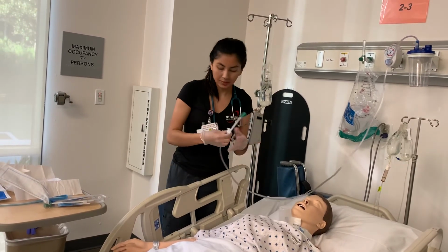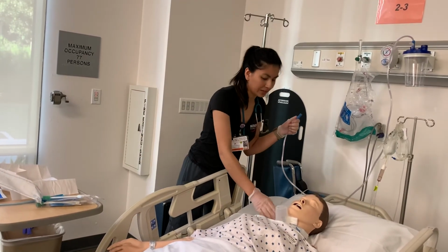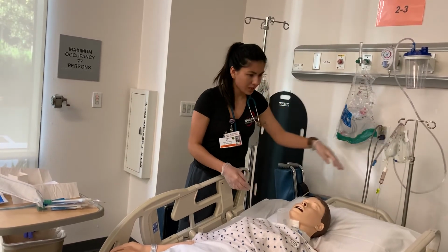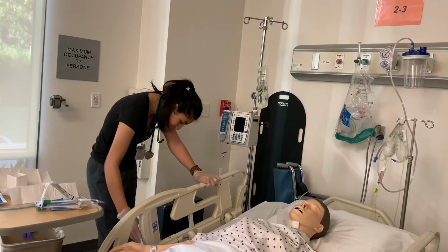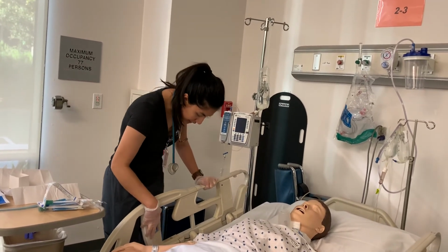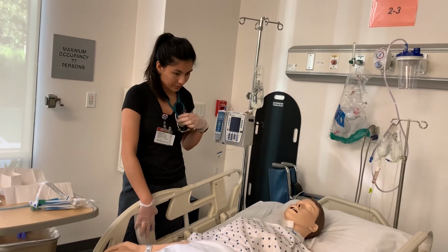All right, looks good. And then once I'm all done, I would tighten the collar again, and I would turn off my suction. I'd make sure she's okay, vitals wise, and I'd lower the bed. Jane, can I get you anything else right now, or are you all right? No, I'm okay. Okay, so the bed's in the lowest position, and are you okay with sitting up like this, or do you want to be laid down? I want to sit up. Okay, she can sit up.